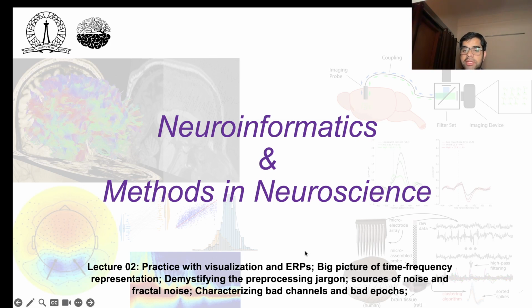In the last lecture we were discussing a few pre-processing steps. A lot of terms might seem very complex, but today we will go through each one of them and get a deeper intuitive picture of it. I'm not going to show the equations or anything, and if time permits, we will discuss some of the noise sources.